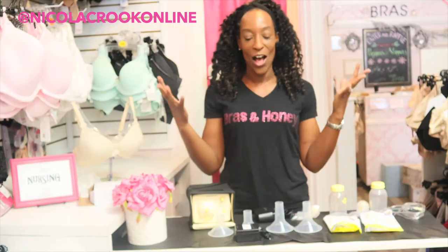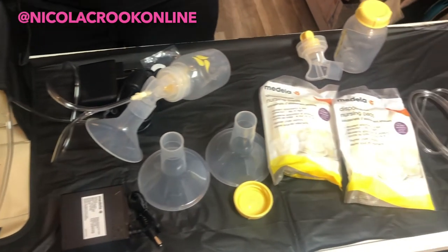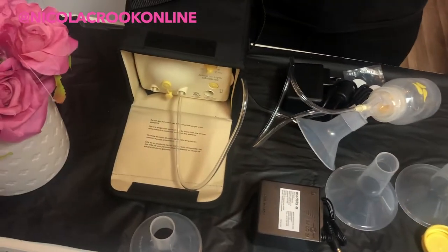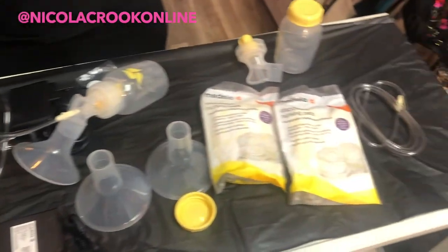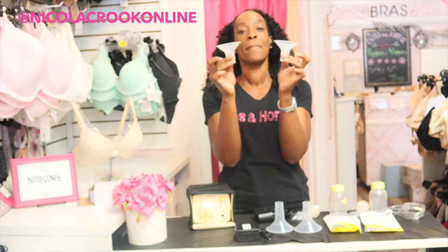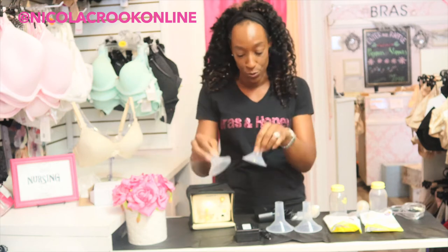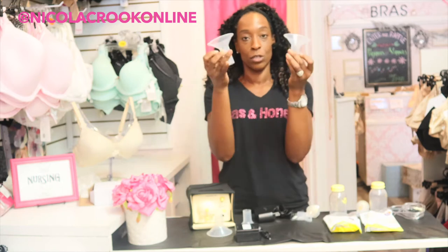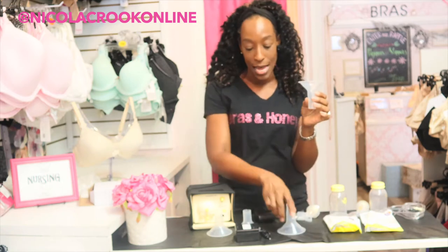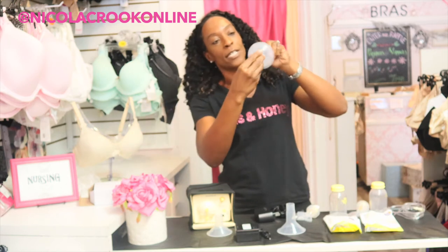I've got everything out of the box — I'm sure you didn't want to watch me fight and struggle with the box — so I thought I'd lay it all on the table. In the actual box you will receive two breast shields which are 24 millimeters — they're the personal fit breast shields. You also get two larger breast shields and these are 27 millimeters, and you can see they're ever so slightly different in size.